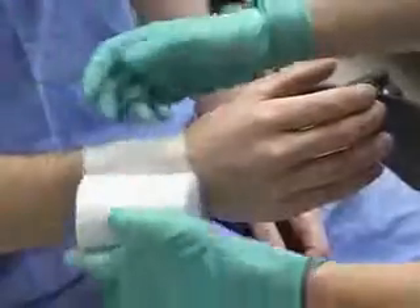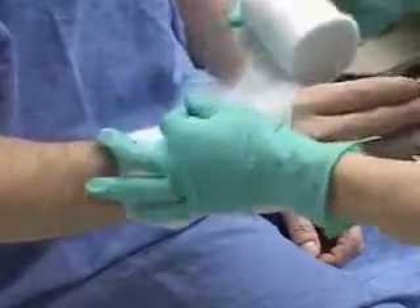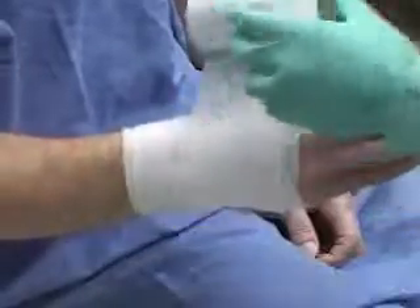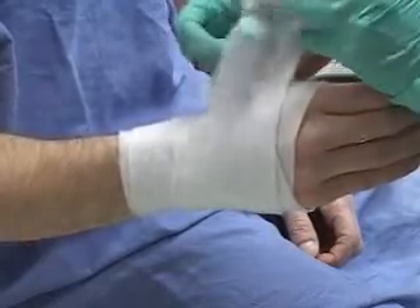We'll start the web roll at the wrist, working up and around the palm with no tension. You can tear the roll to accommodate the thumb, or poke a hole, making sure the palm is well padded.